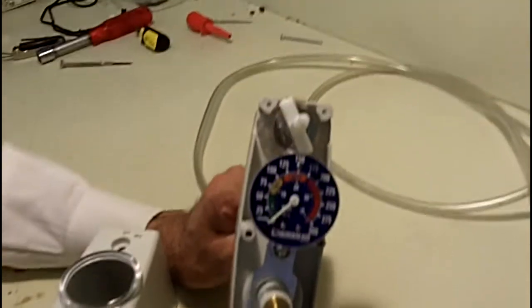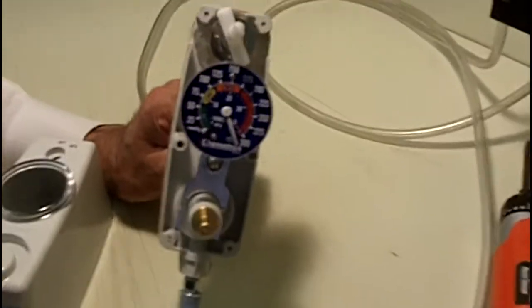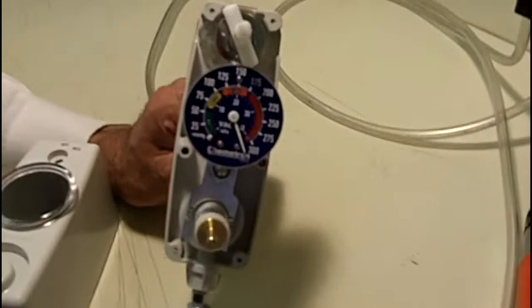And you'll notice when we turn the vacuum source on full and it's completely blocked off, you're going to see it's going over 300 millimeters of mercury.